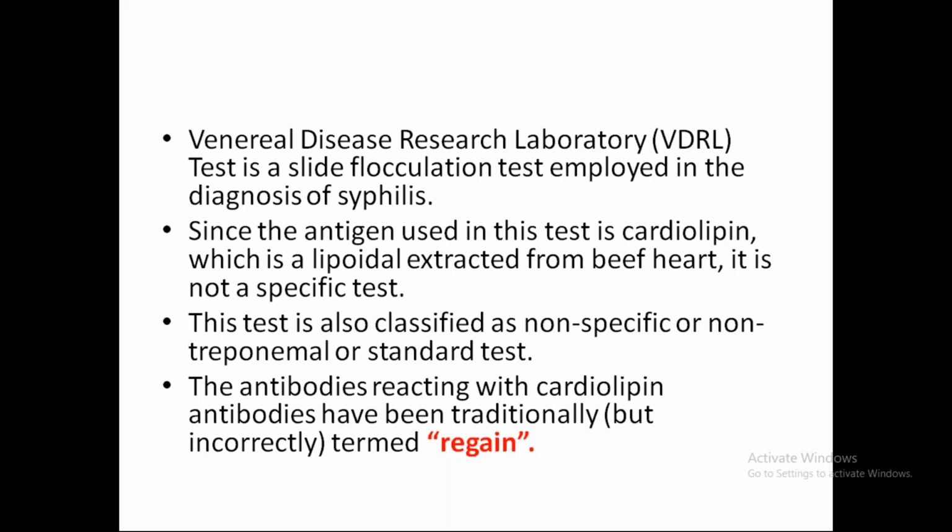So, as a result, it is not a specific test. This test is also classified as non-specific or non-treponemal test or standard test. The antibodies reacting with cardiolipin antibodies have been traditionally termed as reagin.